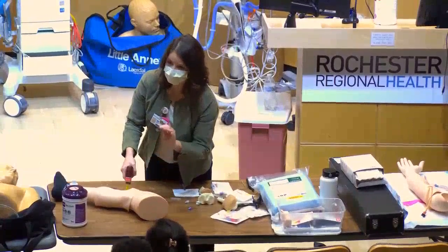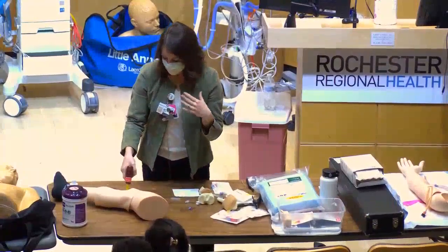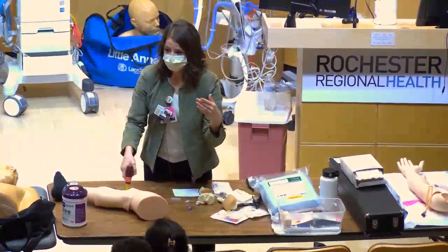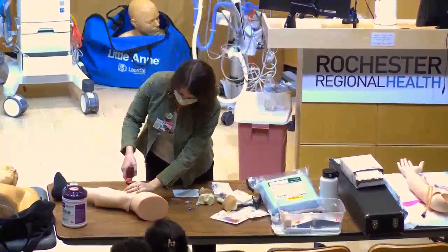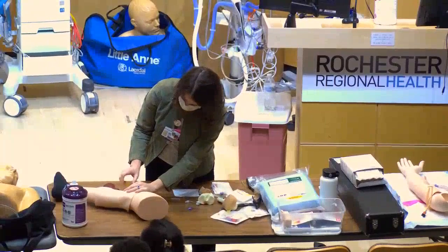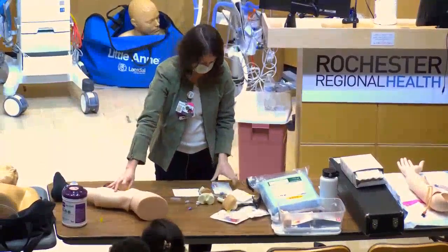You'll feel a release of tension — a pop — which means you're inside the marrow. Don't continue pushing the needle in further or you could go through the other side of the bone. Remove the drill, then unscrew the external needle — that goes in your sharps container. The IO is in, but it isn't secured yet.